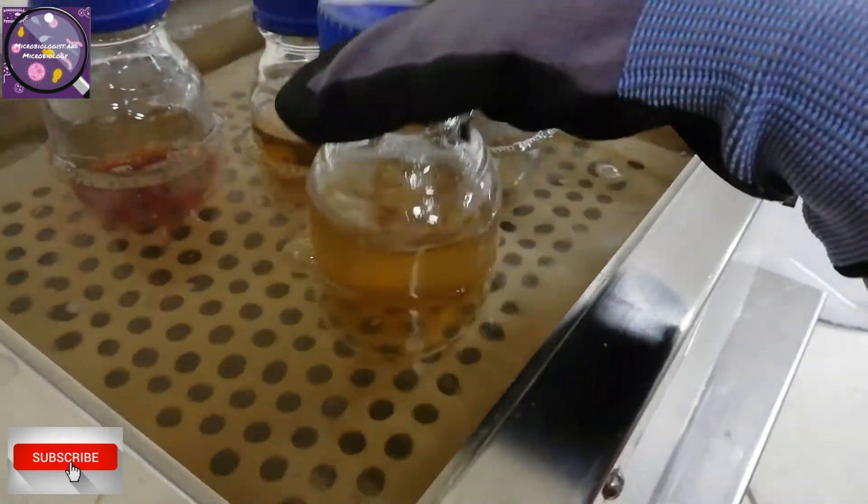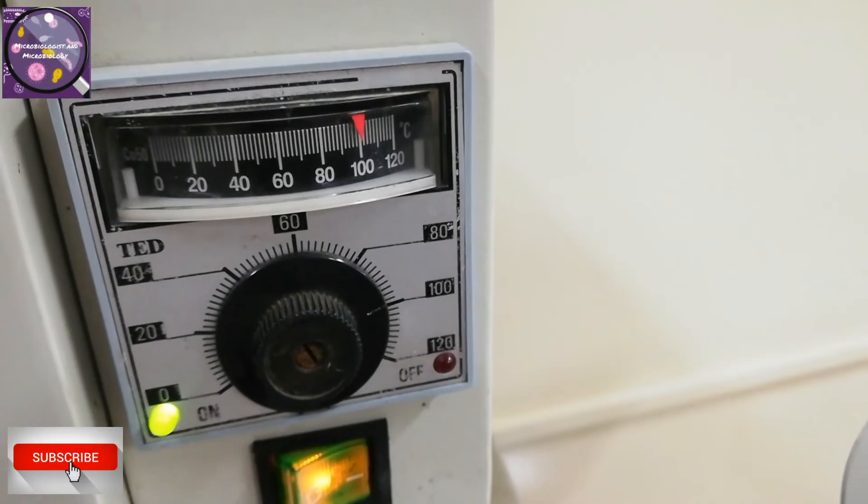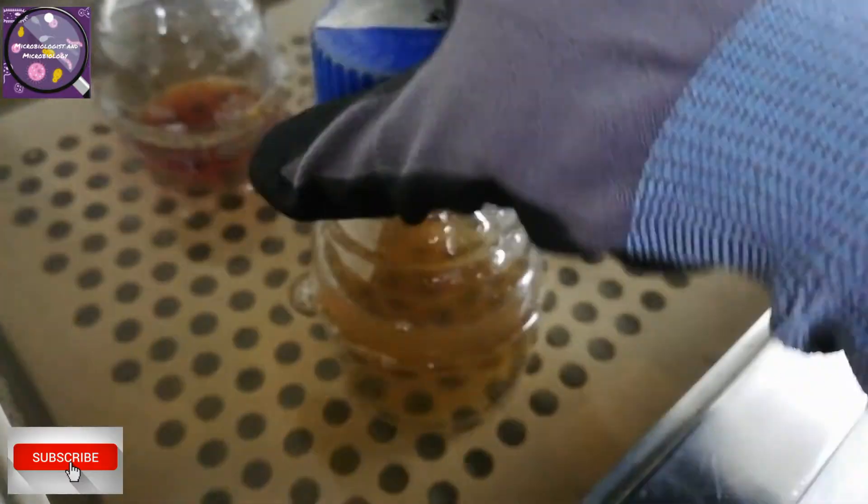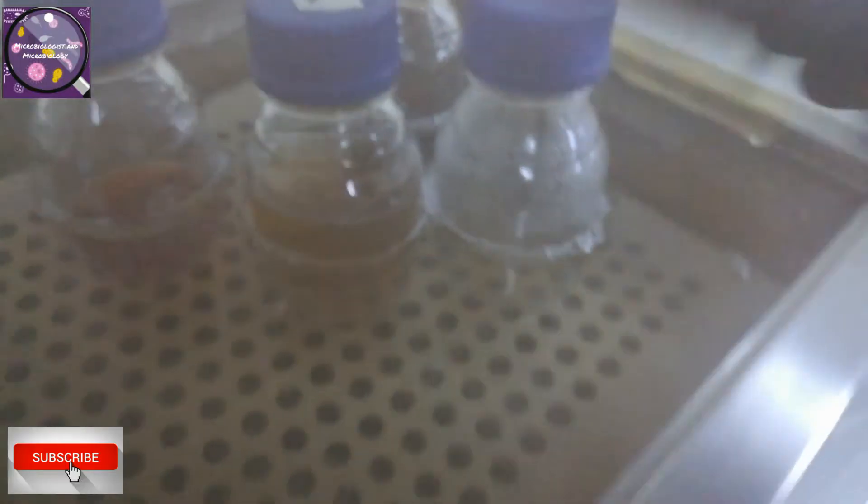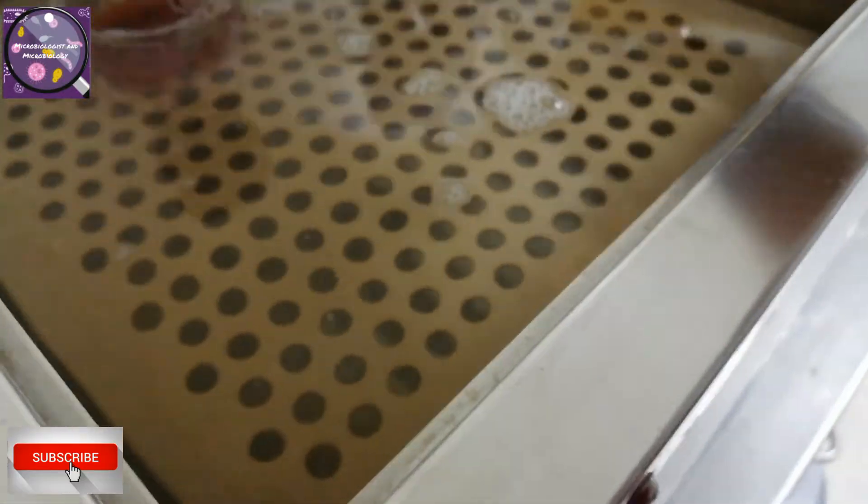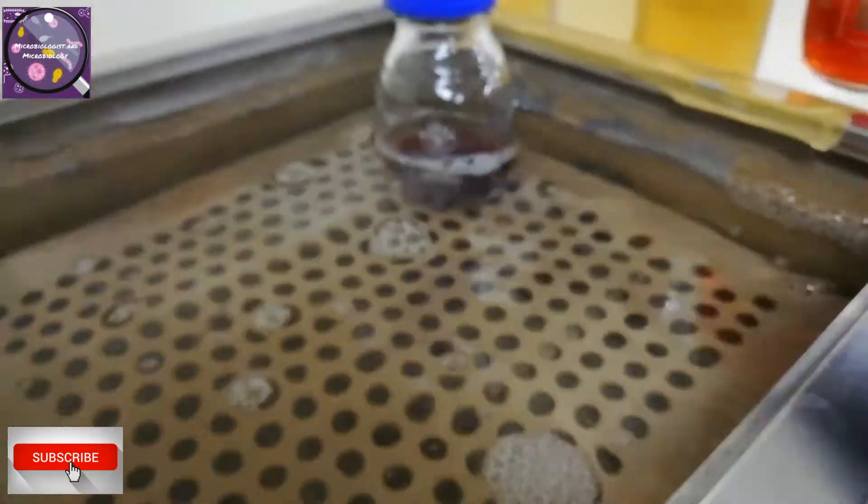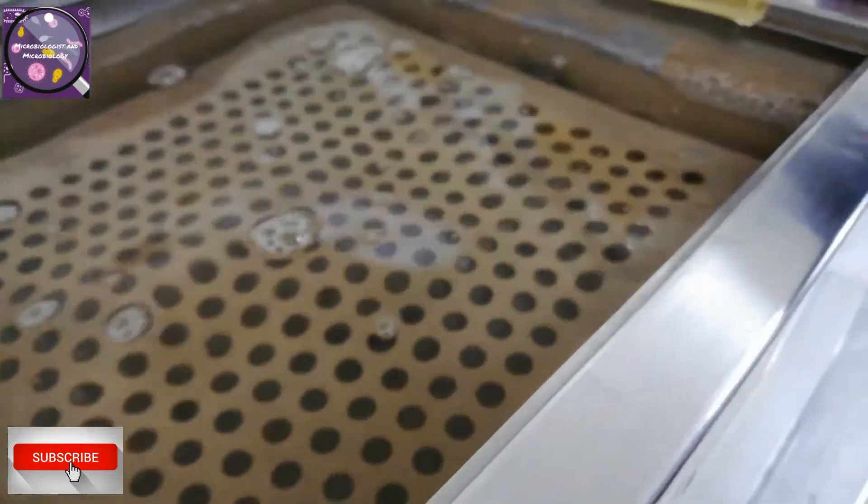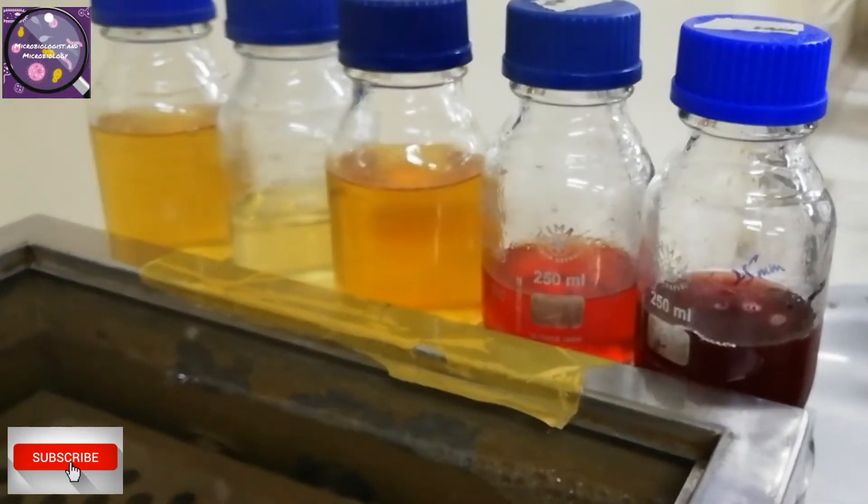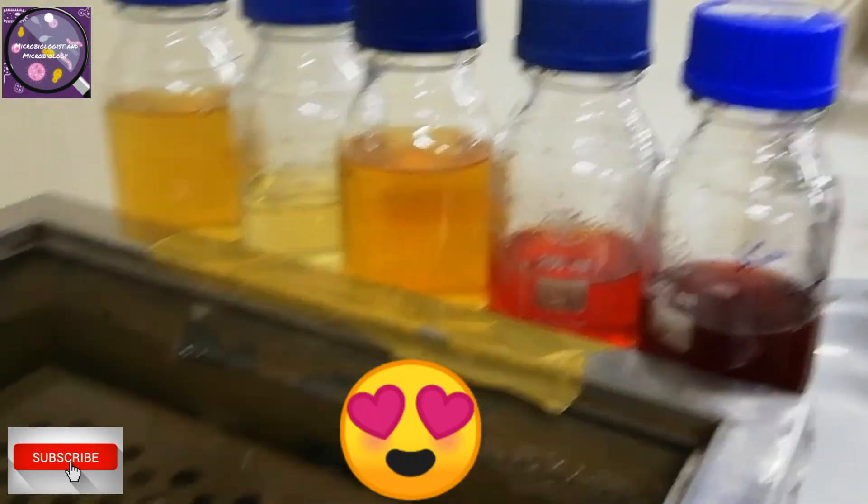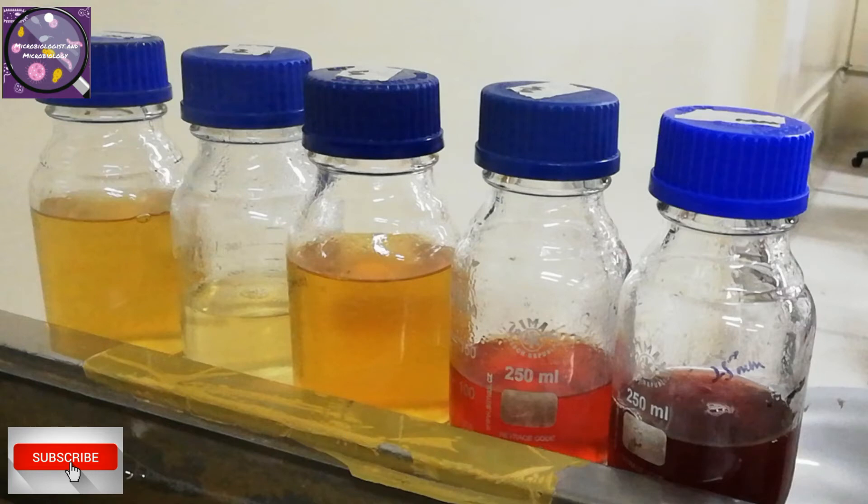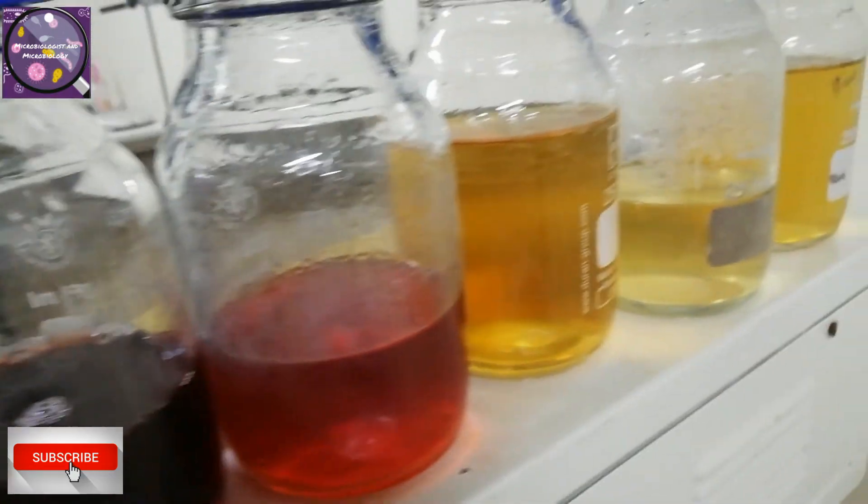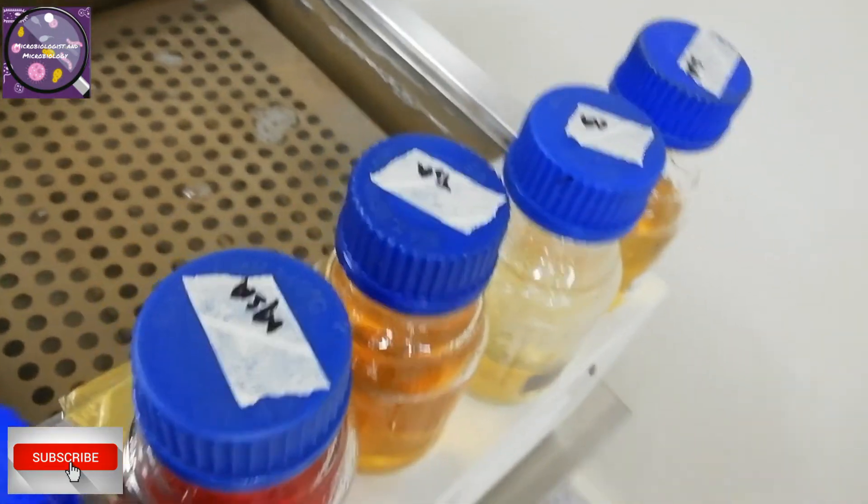After 45 minutes of continuous agitation and heating process the media becomes transparent, as you can see, that means it's done. Now I will remove these media bottles carefully from the water bath. Can you see these colors are looking very beautiful. Now I am going to do steam sterilization process through autoclave to sterilize all these media.